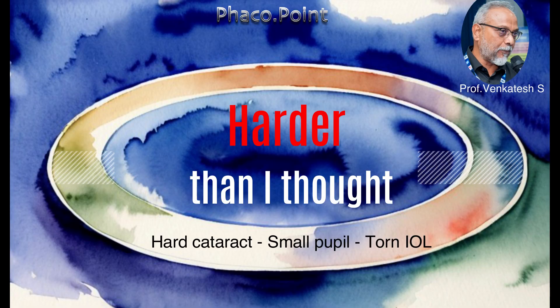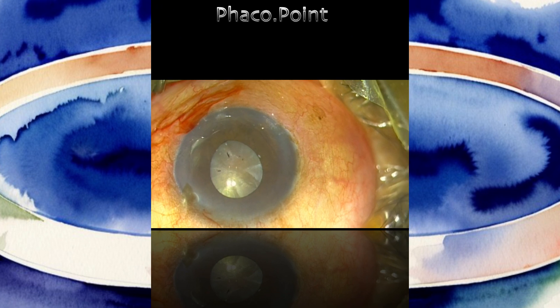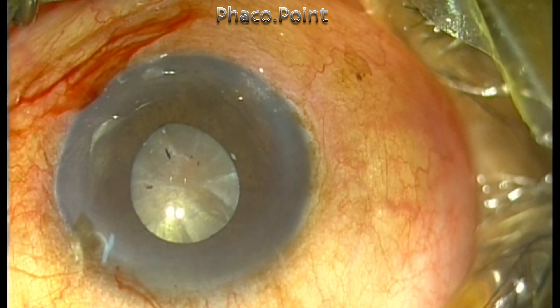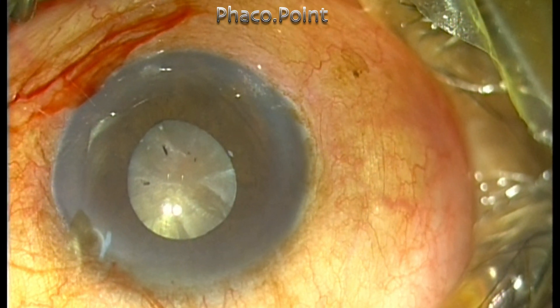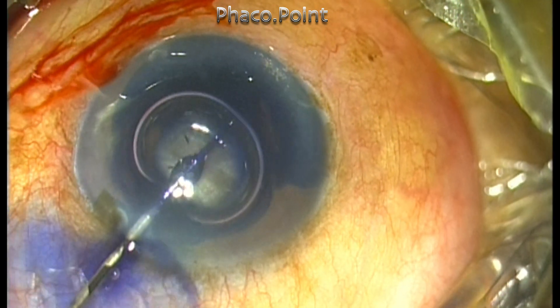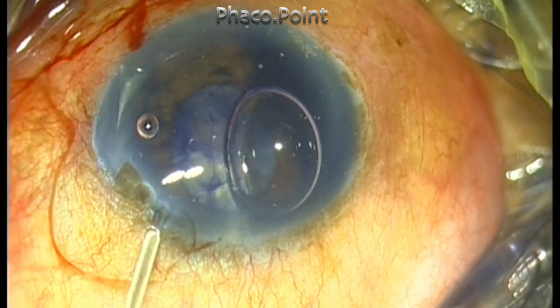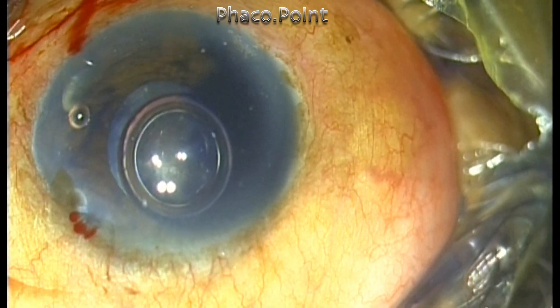Hello dear friends, I'm sharing this video because this case turned out to be much harder than I thought. The patient was a 93-year-old individual who had a very hard cataract. This was the maximum pupillary dilatation that I got, and I also found that the anterior chamber was very shallow. Stay with me because there are lots of points of learning in this video.